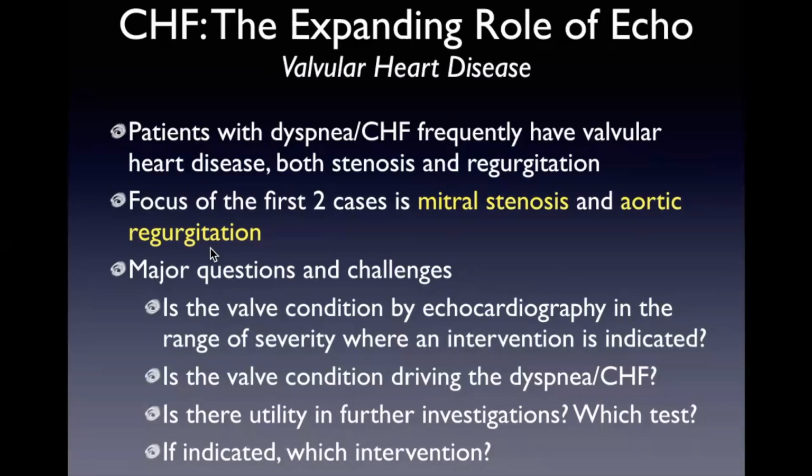I think the one caveat perhaps, and we don't have as much data, is in the setting of mixed valve disease. So there's some data that, for example, a combined moderate aortic valve stenosis with moderate aortic regurgitation together can cause enough hemodynamic consequences to cause patient symptoms that could drive an intervention. And then on top of that, have that intervention result in improvement of symptoms and improvement of quality and ideally longevity of life. So the real gold standards as to why we need to intervene.